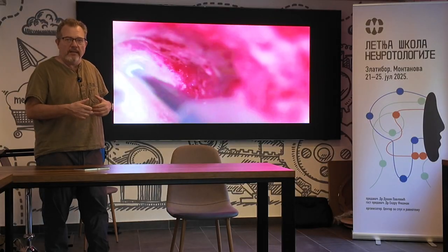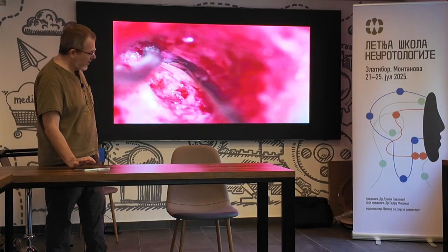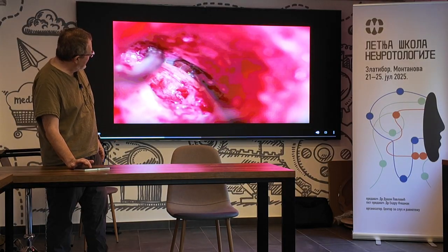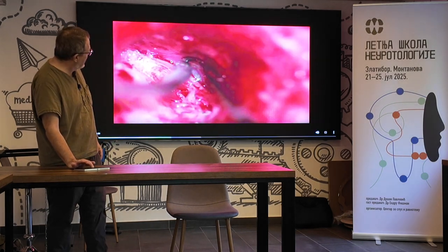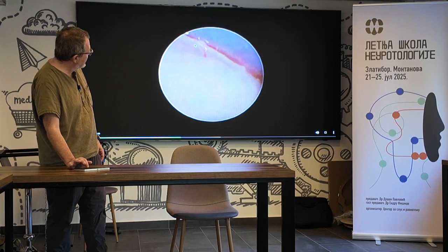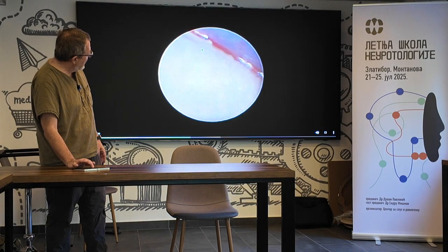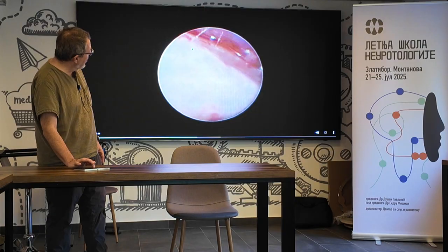So you will find not just the dehiscent canal, but you'll also find many holes in the floor that need to be resurfaced. And in this particular patient, especially if the dehiscence is more on the lateral or posterior aspect, you can easily see it by elevating the dura and putting in a little endoscope. So I put an endoscope here, and we can see here the fistula. See, so here is the fistula right here. And this is the dura, and I'm going in through the mastoid, and I use an angled endoscope, and I'm going to plug and resurface this, so that it's actually a fairly large fistula.